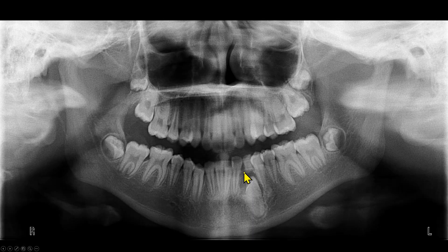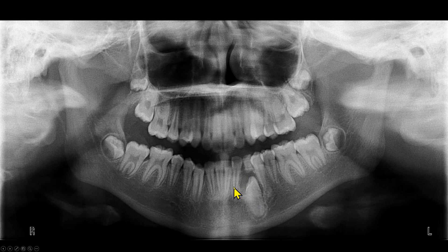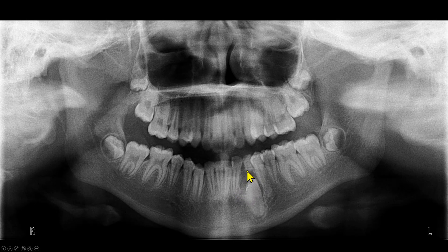Let's review how this area looked a few years ago — the same patient a few years earlier. The canine is vertically oriented. The follicle of the canine is wide, almost looks like a dentigerous cyst. The lateral incisor is slightly displaced. The premolar does not appear to be displaced. So in a few years, this radiolucent area developed the complex odontoma. Most likely, this radiolucency was the follicle of the developing complex odontoma.